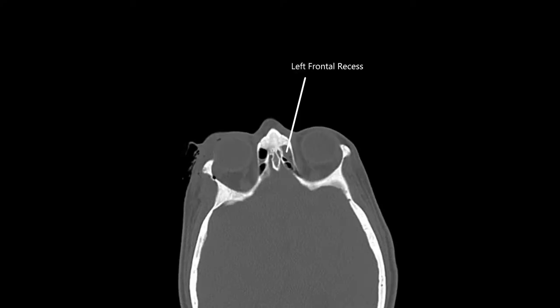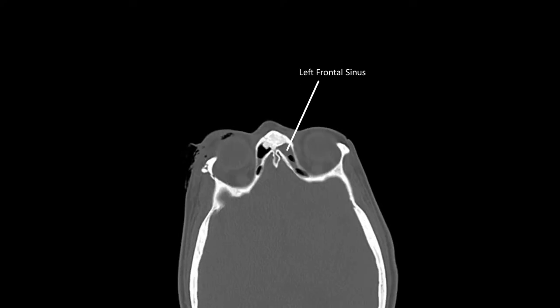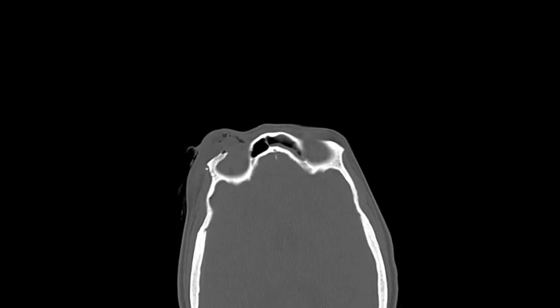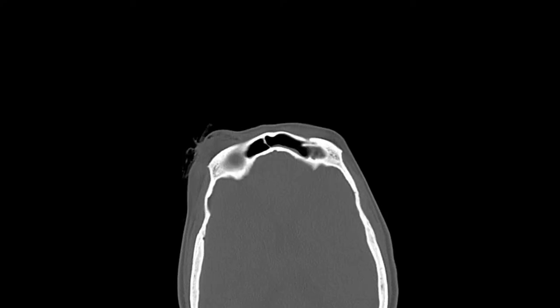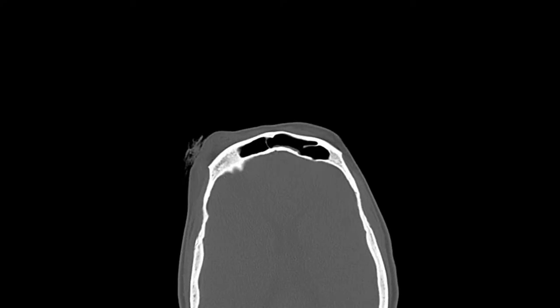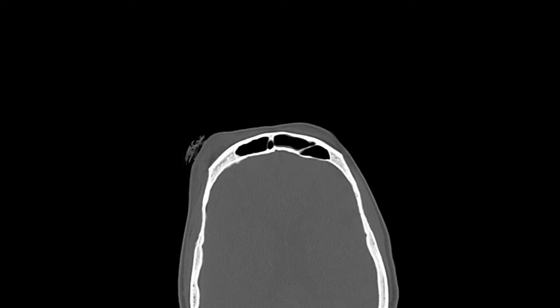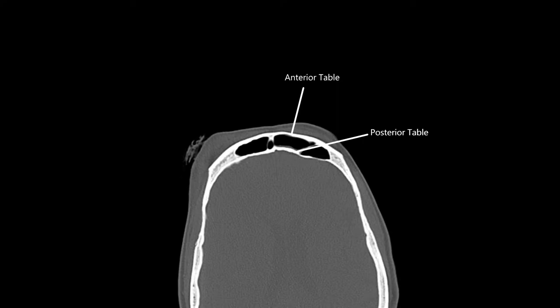Scrolling up superiorly, the left side of the frontal sinus has some partial opacification, signifying that there is some sort of bony fracture nearby. However, the frontal recess and the anterior and posterior tables of the frontal sinus are intact, so there's no issue with the frontal sinus.